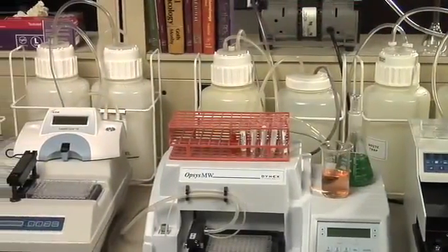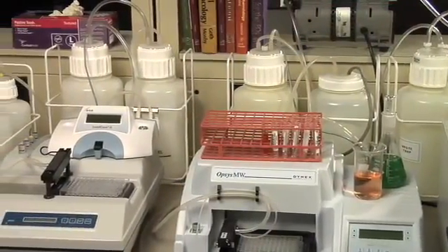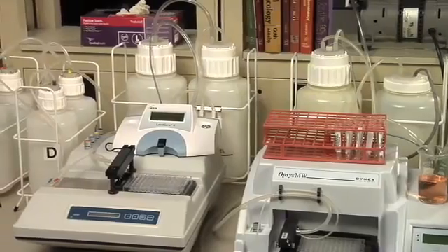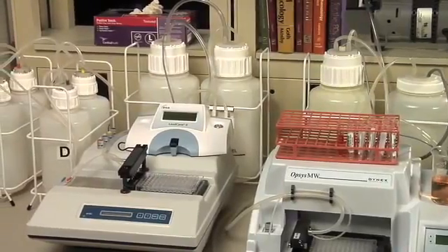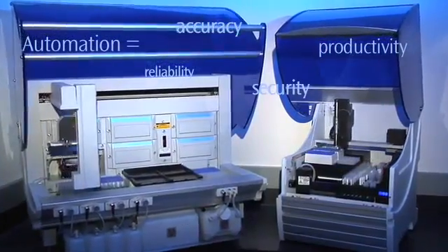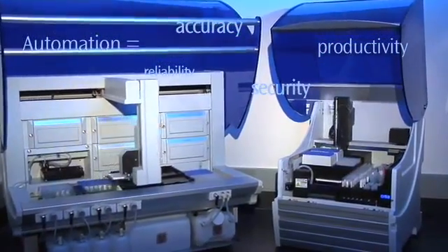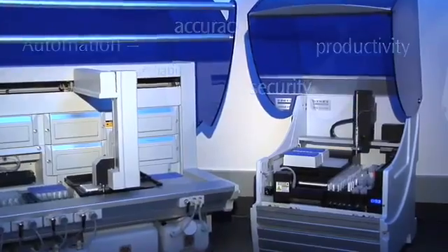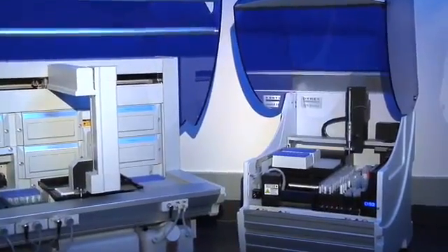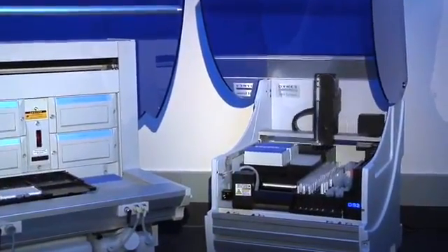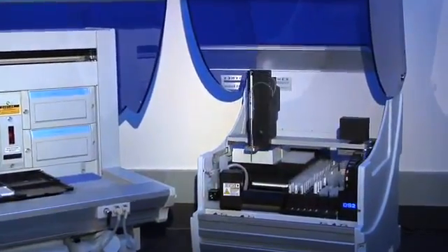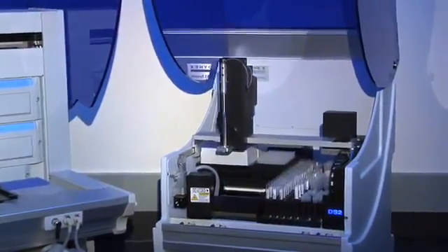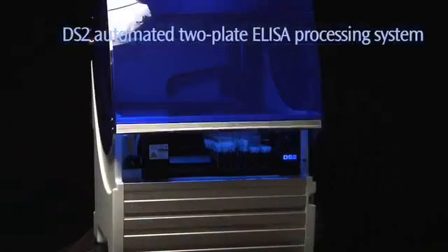Your performance requirements are huge, but your benchtop space is almost non-existent. That's why Dynex Technologies, the innovator behind the popular automated DSX four-plate ELISA processing system, designed a two-plate system to meet the demanding needs of lower throughput labs like yours.